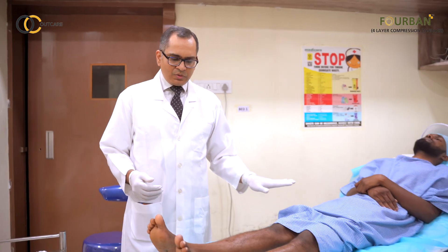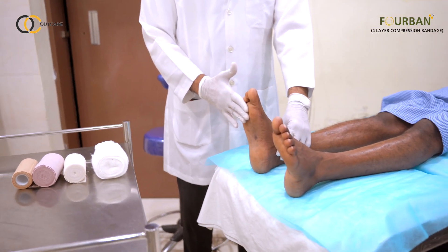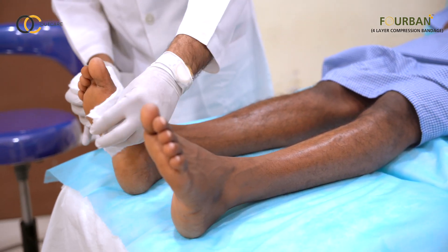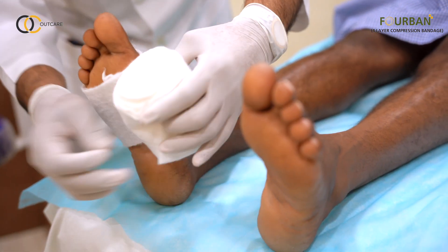The patient is lying in a comfortable position on the couch. The ankle should be at right angles for us to start the procedure. Now I will be taking the first layer — the orthopedic bandage or the soft roll.